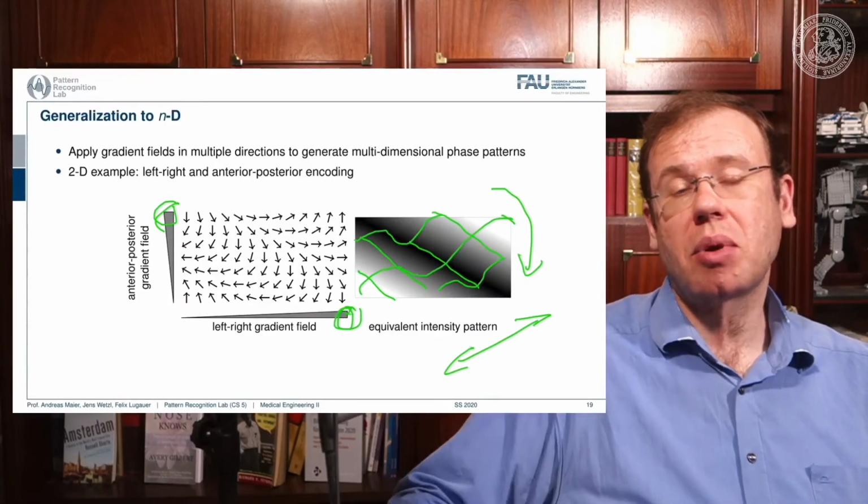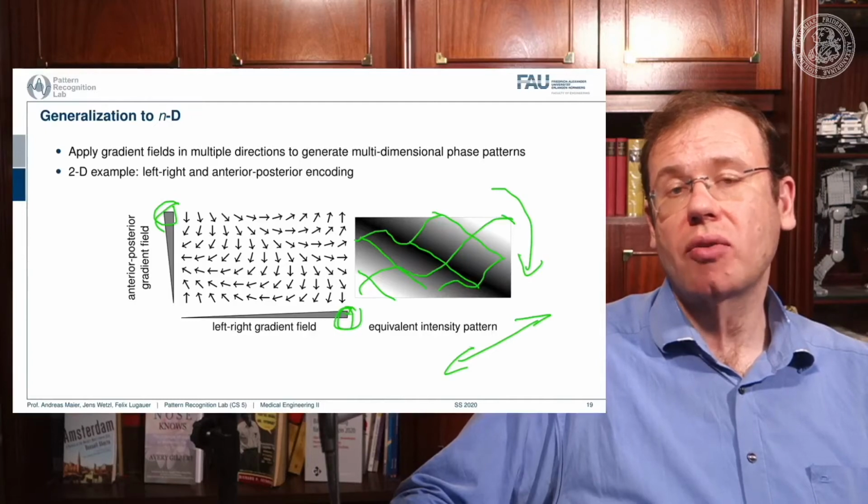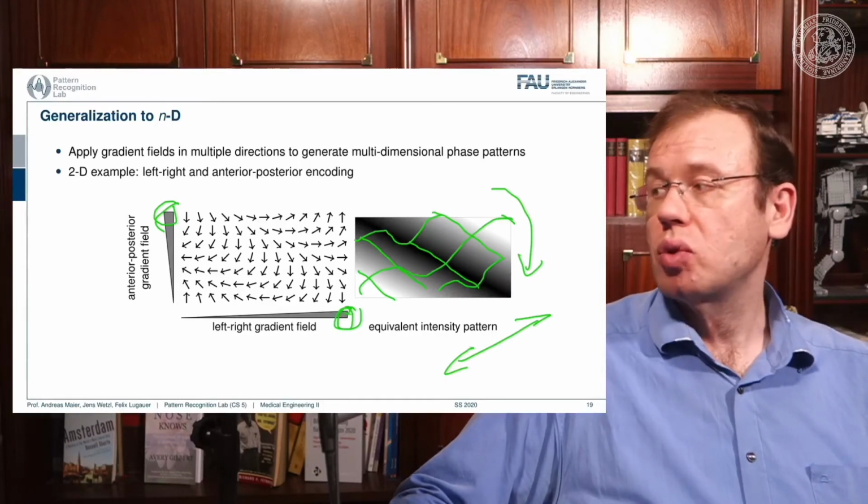This can be applied with the different combination of the gradient coils in 2D directions.